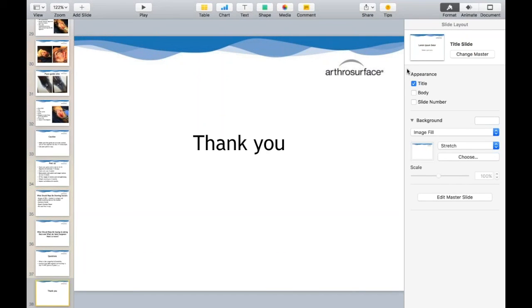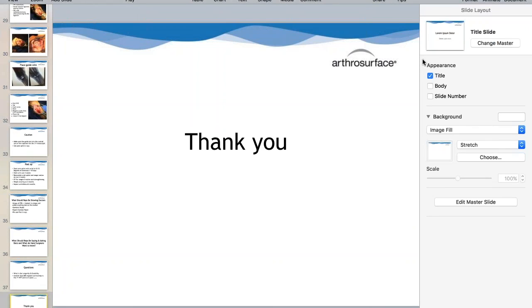Size loose or tight if undecided? I guess that refers to the sizing. So there's basically two different sizes for the head of the capitate, and then there's the different radiuses for the lunate that you can measure, because we measure the lunate fossa on the PA and the lateral planes. And I think for the radius of curvature, when in doubt, if it falls between two, go with the bigger one. But the screw sizes, the cap that goes onto the capitate, when in doubt, go smaller, if that makes sense.